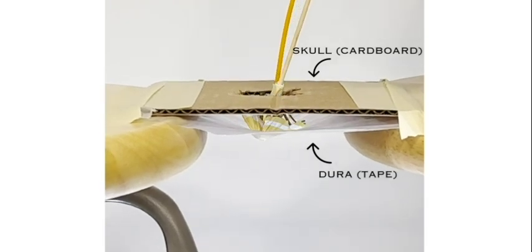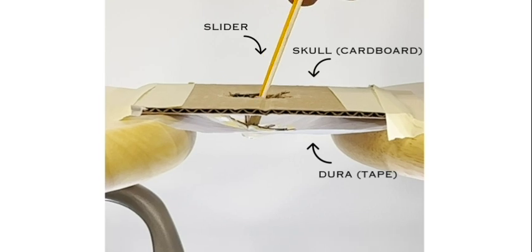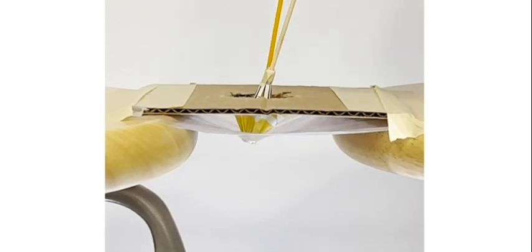During the procedure, the umbrella remains closed when being inserted through the bony defect. Once it enters the defect, the user can engage the slider mechanism to open the umbrella, thus separating the dura from the bone and elevating it. Once deployed, a press of the button will release the graft from the pinchers. Now the user can simply slide the umbrella closed and remove the tool from the cavity.